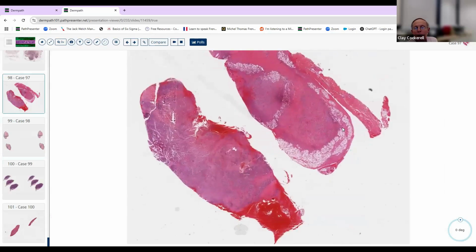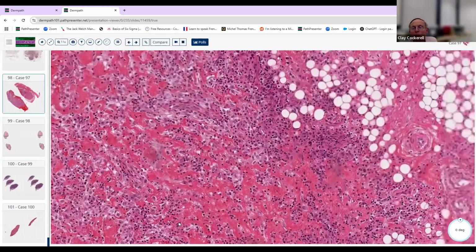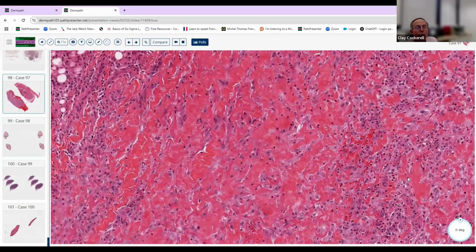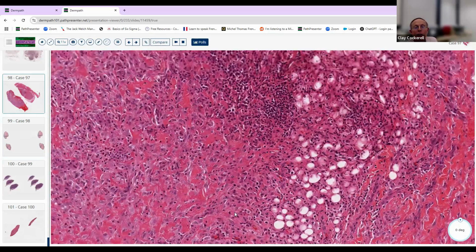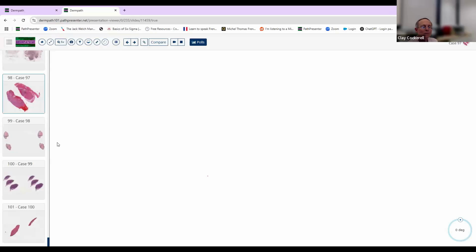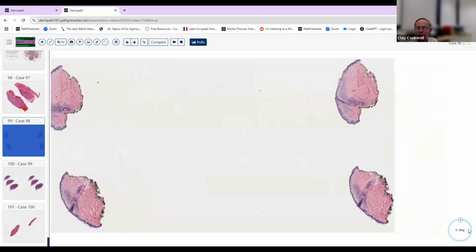Okay, so I can go back to this. I apologize, we keep losing our computer image, I think. Anyway, this was cocci. So go back and look at this one and find organisms of coccidioidomycosis in here. Okay, we're down to the last couple.